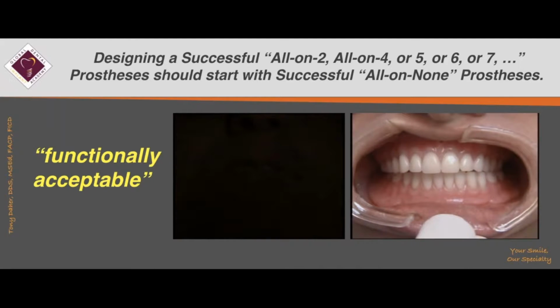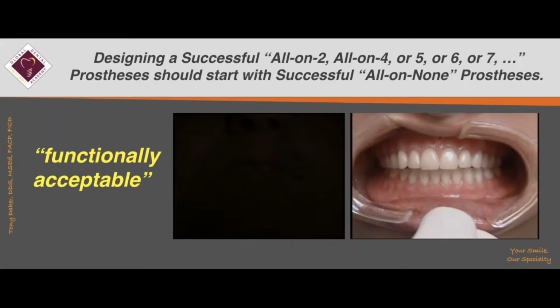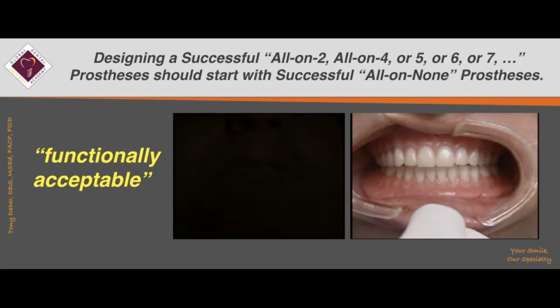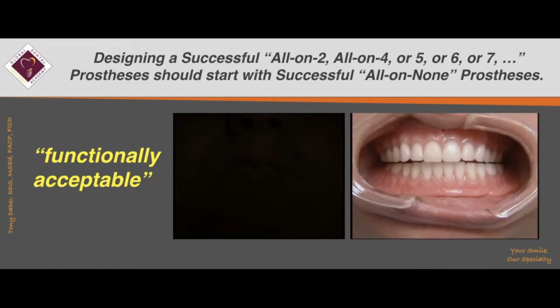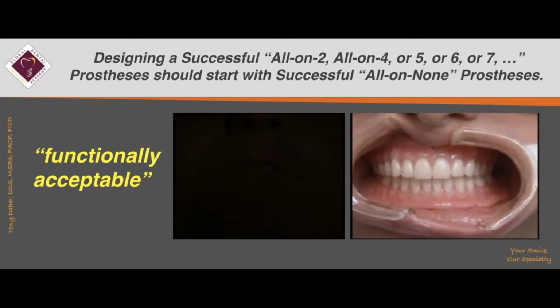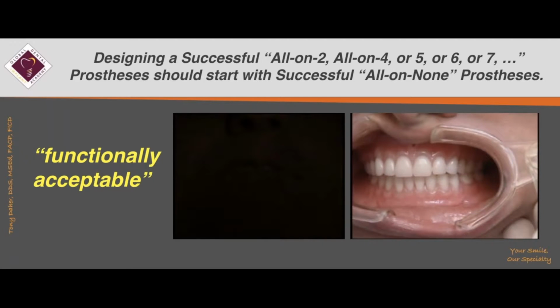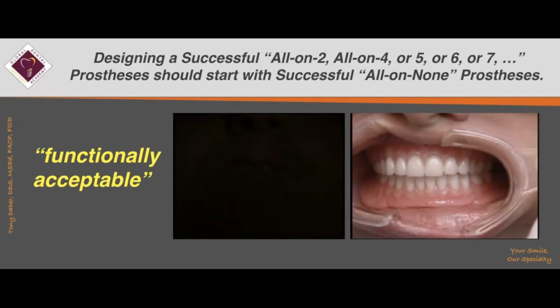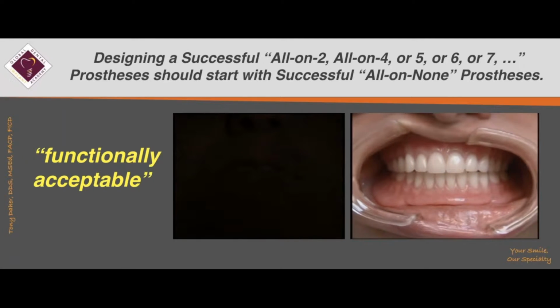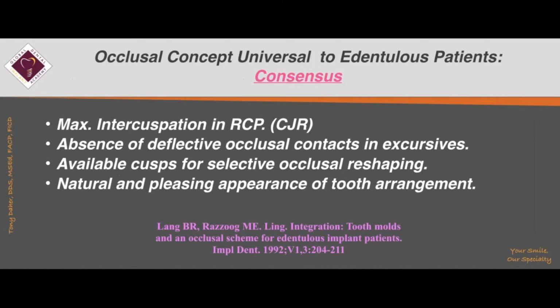Back. Side. Back. Okay. Now slowly grind left like an arm. Okay, hold it. Very good. Now bite all the way in the back. Chin down. And move the teeth over like this. And like that. Okay. And here on the top. Smile. Very good.